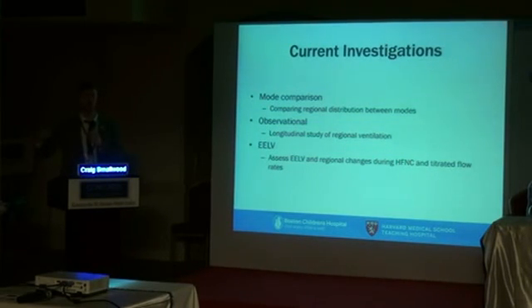control. It just may mean it's less convenient because you have to be there to make sure that when the system compliance changes or the airway's resistance changes, you are there to change the pressure. But the question I think still remains, especially in the pediatric data, what is the difference between pressure and volume control? Is there any difference in regional distribution? Because we can't just say that the volumes are the thing that are different or important. And also during spontaneous breathing too, there's a couple of new modes, and I'll show you one such finding.